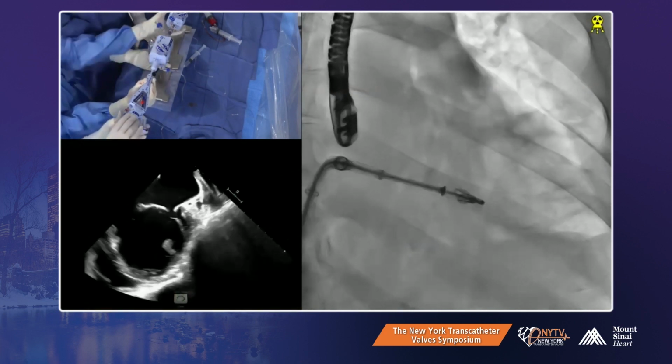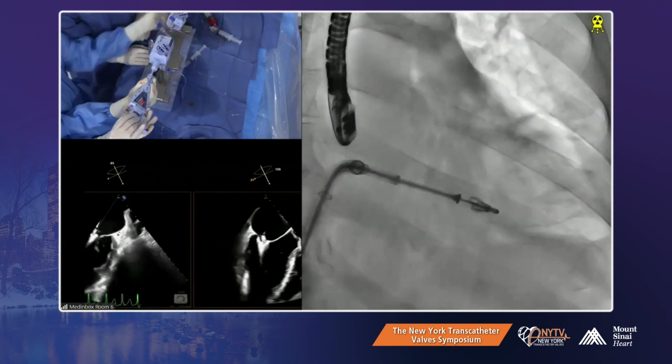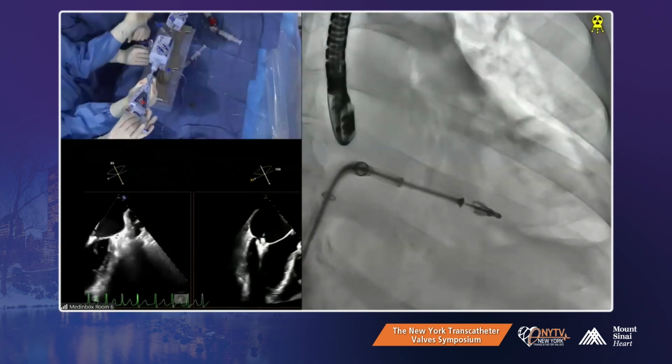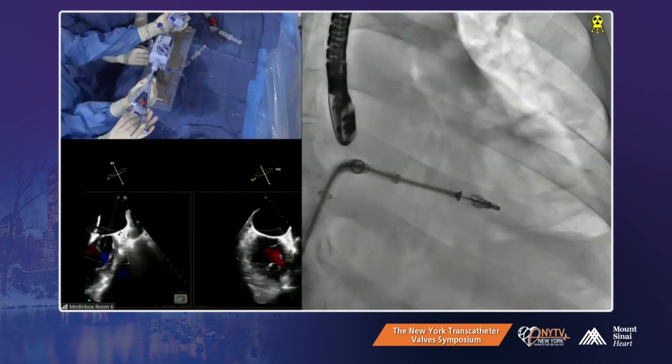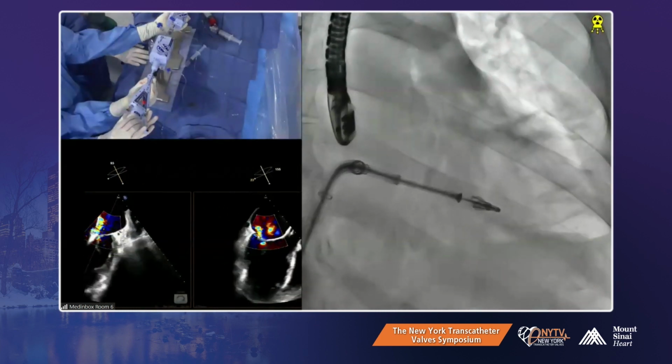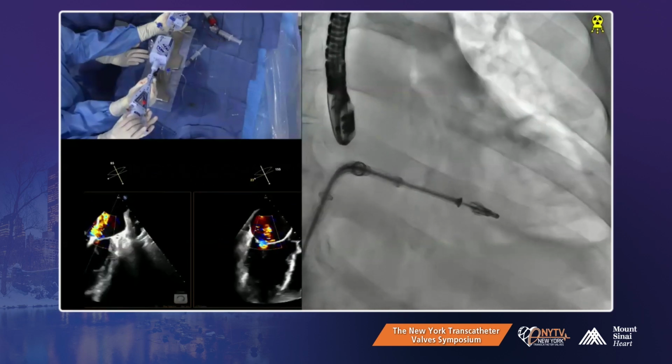Can we show color and we close? Yeah. Okay, we're gonna close now. We're gonna do a little more posterior guide torque. That looks pretty good. Color, please. Are you happy with the insertion now? Stan? Yes. We'll see. Closing. Can you put the cursor on the clip, please?